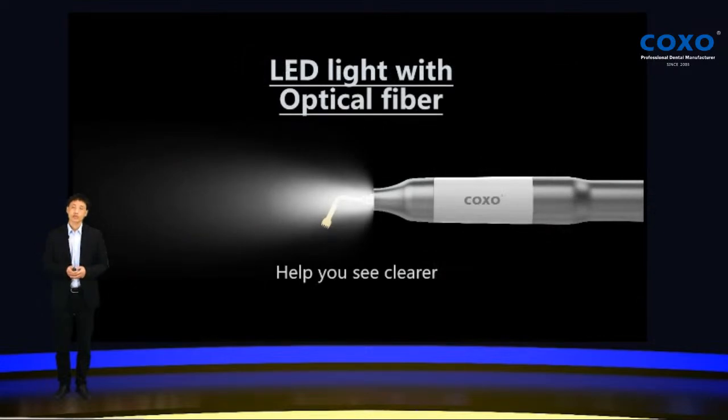COXO Explore features LED light and optical fiber. You can make the lights always on, or you can make it off. You can also set it to auto-on and auto-off — it depends on how you want it to work. It will help you see more clearly on the treatment areas.